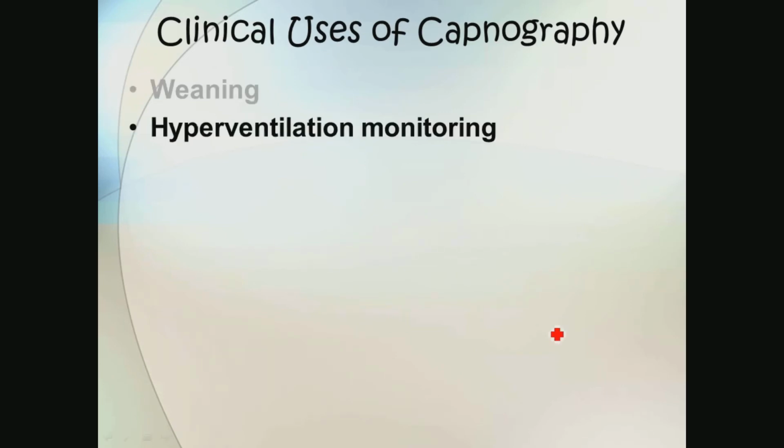If we're in a situation where we want to hyperventilate somebody, say for a head trauma, it's nice to monitor with end-tidal CO2 there also. It's also nice to monitor ICP on those patients, and ideally having an implanted oxygen sensor to be able to identify a cerebral PO2.